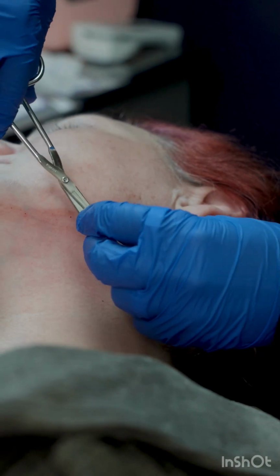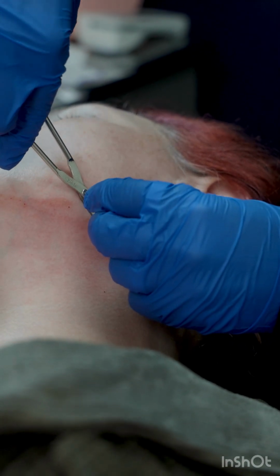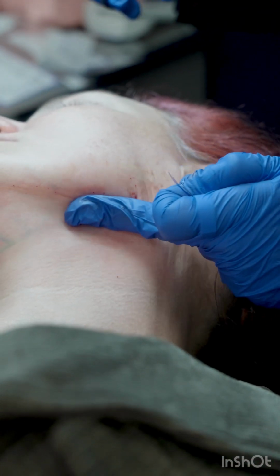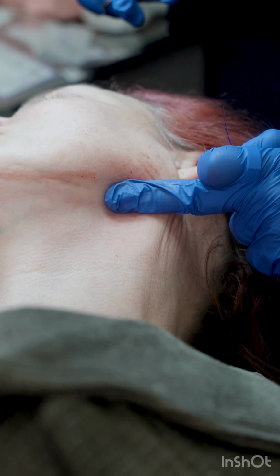Once that is complete and all the threads are in place, I cut off the excess thread from her lifting on both sides. And now let's see her results.